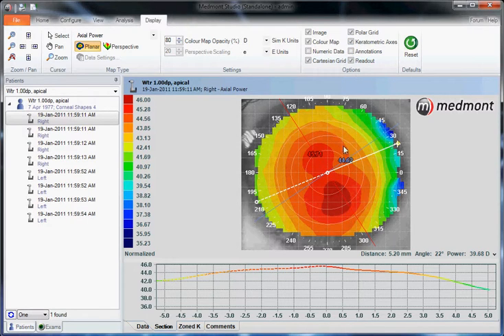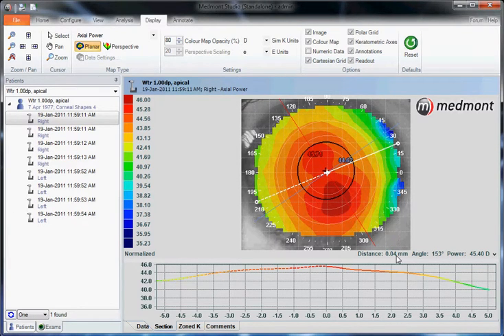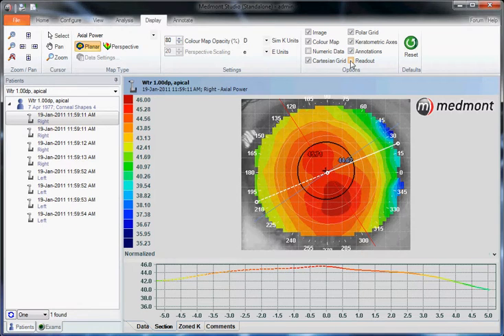Annotations include the pupil or any additional annotations we've added to the window. Lastly, the readout gives us the data for the point where we've placed the cursor. For instance, if we put it in the center, it's at 0.04 millimeters away from center at angle 153 with a power of 45.40. We can uncheck or check that.